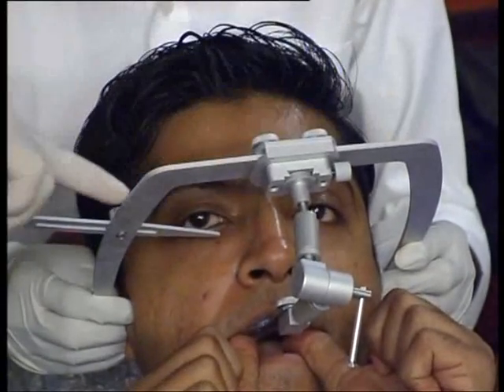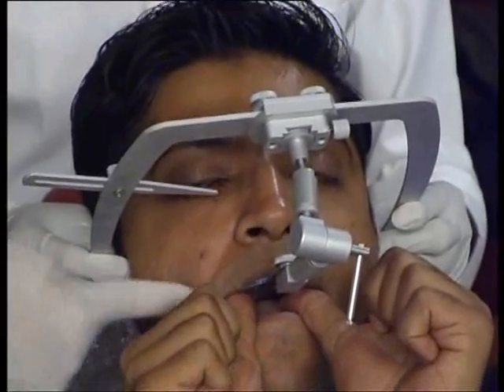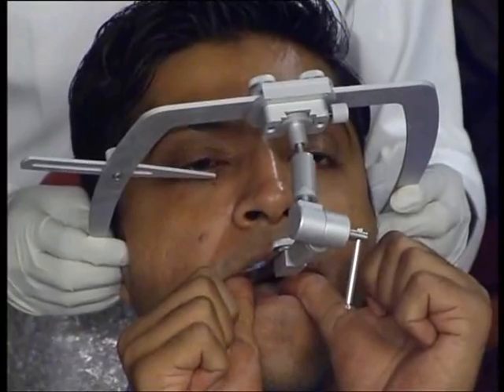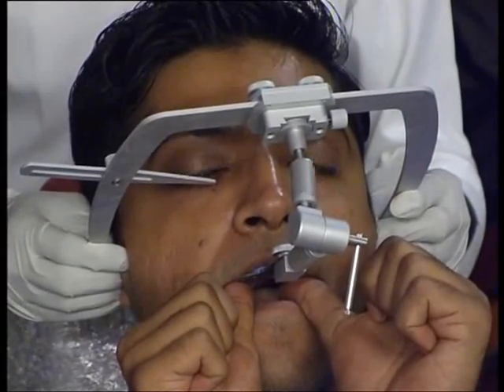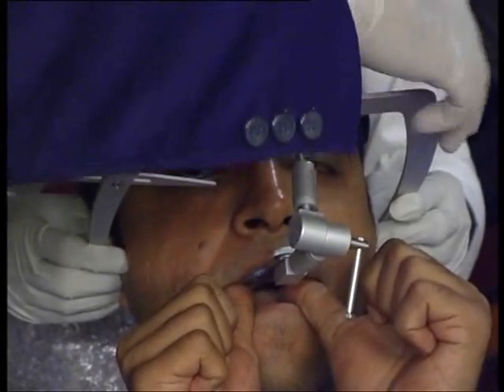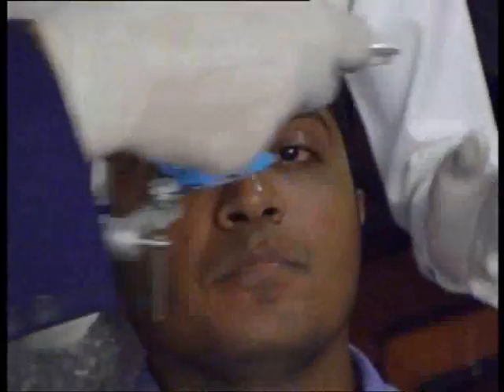The new frame is recording the reference plane, this is recording the occlusion plane, and the transfer assembly is holding the entire assembly together. Once this is done, it's time to remove. The first thing you will do is open these lock nuts — this will open up. Ask the patient to leave, and your face bow is done.